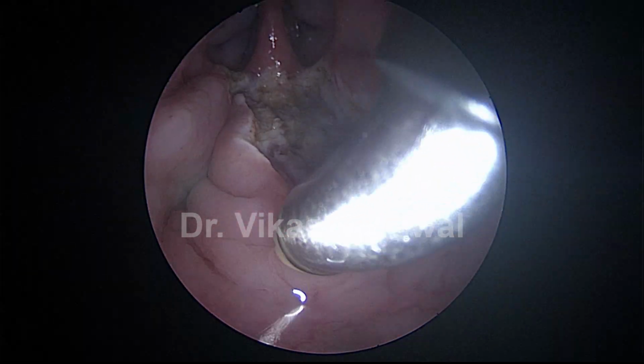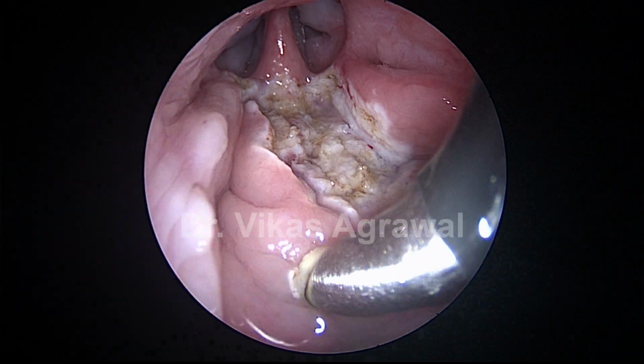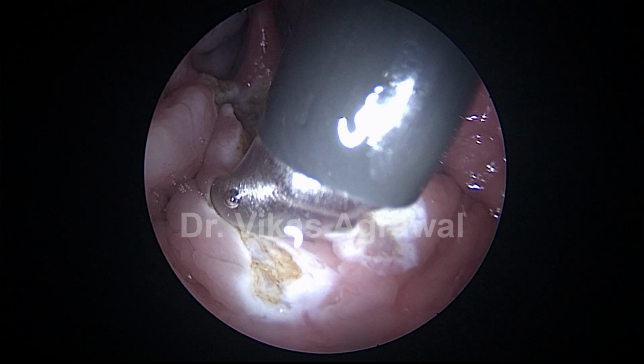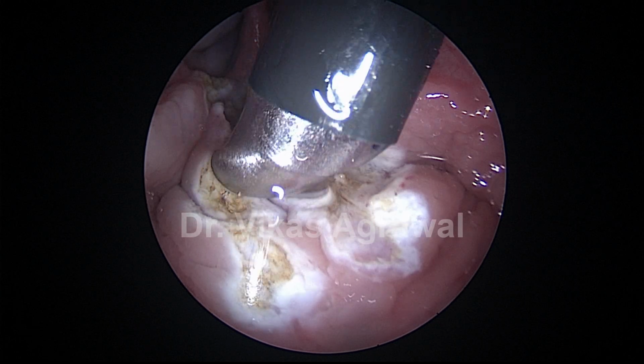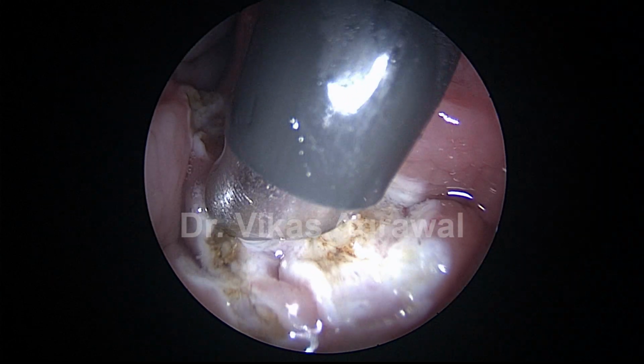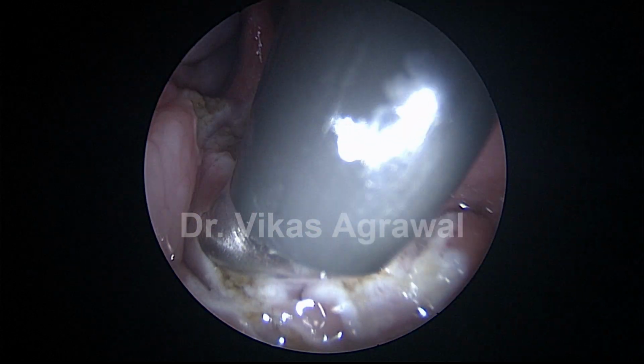Now this is the Passavant's ridge, and you can see a lot of adenoids over here. So obviously let me remove the bulk. I have not yet gone till the posterior boundary, which is the buccopharyngeal fascia.